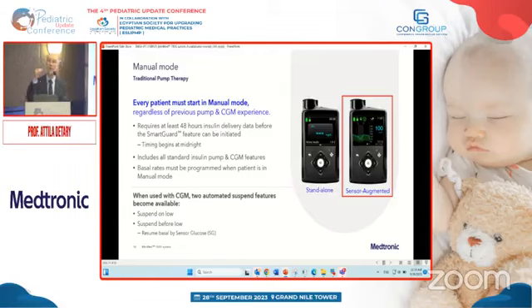Okay, and again, you can either set this for the whole day, 24 hours, or you can decrease it for the early morning when the patient is more resistant and needs more insulin for the same amount of carbohydrates. So it can be, for example, 10 for the morning period, and then a higher value for the rest. So for example, 15, 16. For an adolescent as a start.